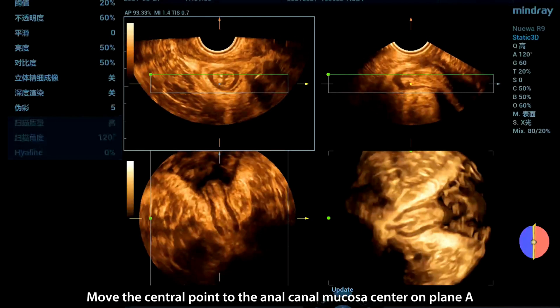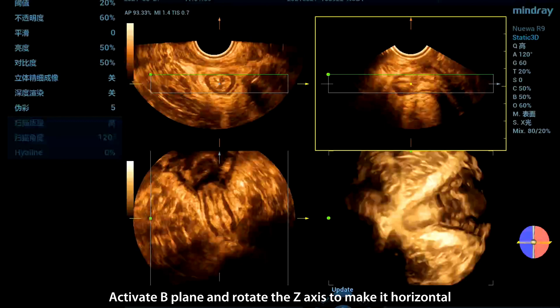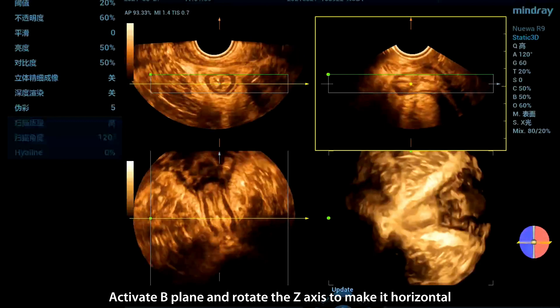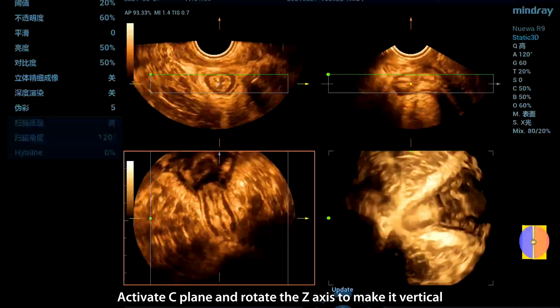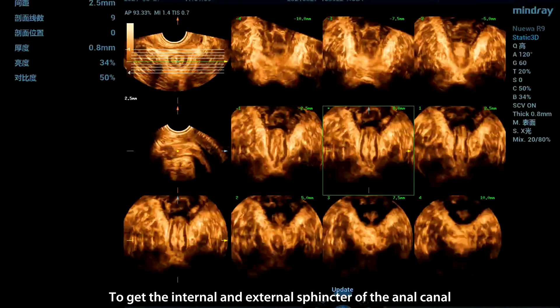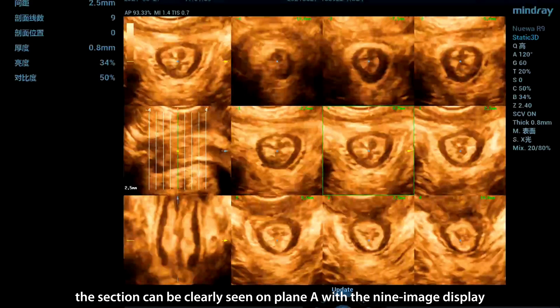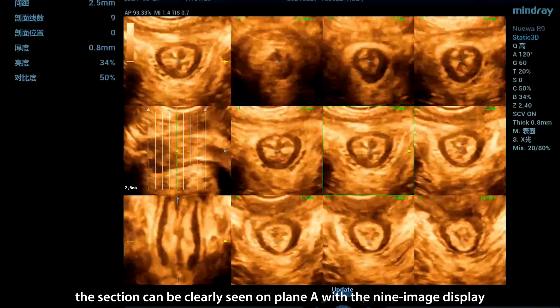Move the central point to the anal canal mucosa center on plane A. Activate B-plane and rotate the Z-axis to make it horizontal. Activate C-plane and rotate the Z-axis to make it vertical. To get the internal and external sphincter of the anal canal, click iPage. The section can be clearly seen on plane A with the 9-image display.